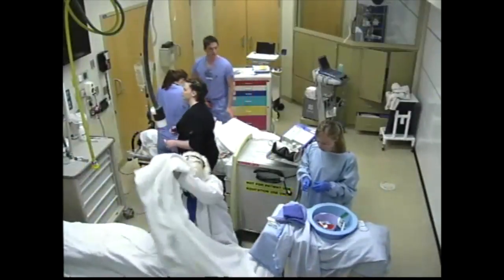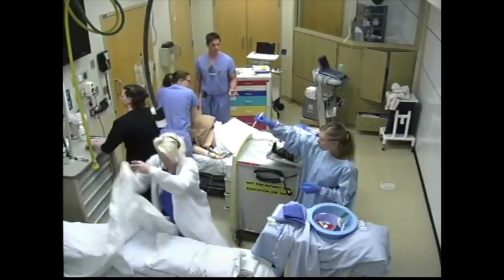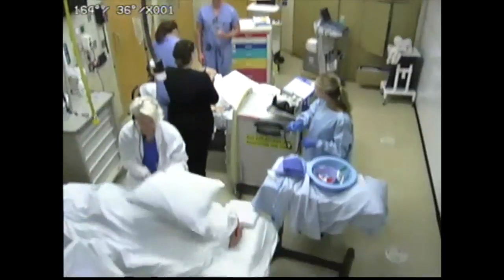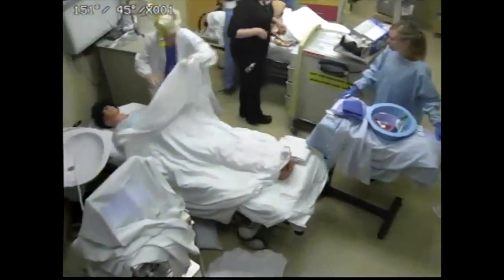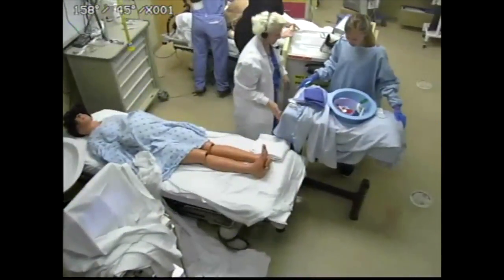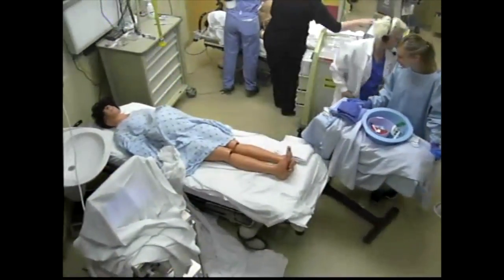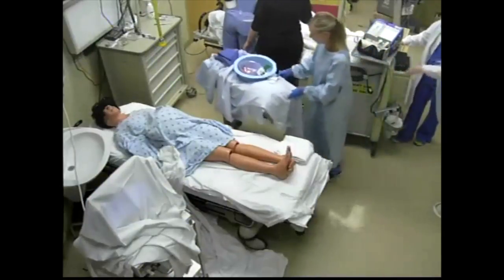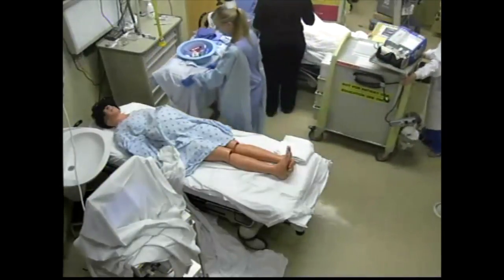Elle, do you remember what to do? Which way to approach? A longitudinal — vertical incision. Yes, all the way through. We don't care about the bladder, just don't cut the baby. Just get at least the uterus too. Absolutely — it's all important. Okay, so go with that.